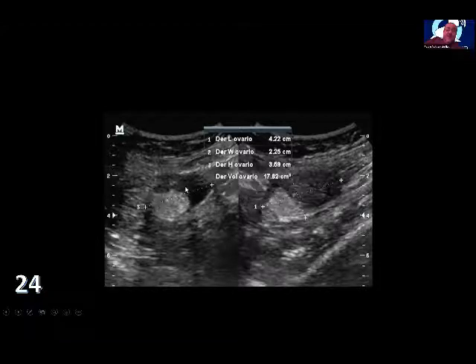This is a case of the most common benign mass of the young female, usually a small intraovarian teratoma. As you can see, this is a round-shaped thing, wider and brighter than the rest of the ovary, with some small bright white spots. I've seen this patient some time ago, and she still has a teratoma.